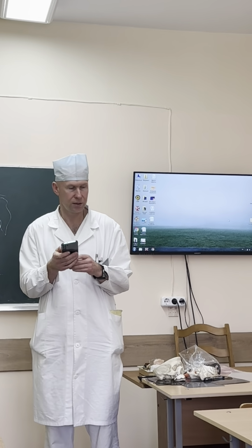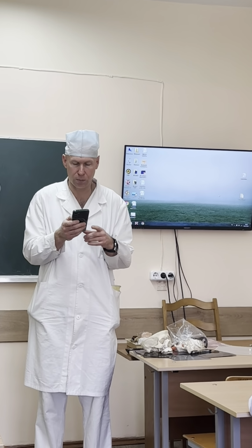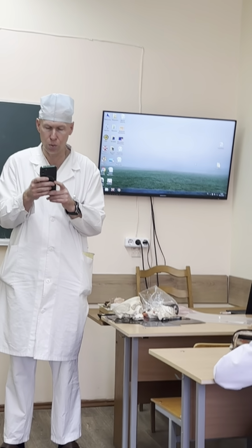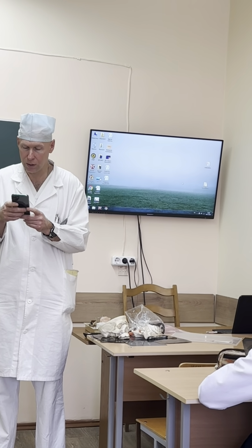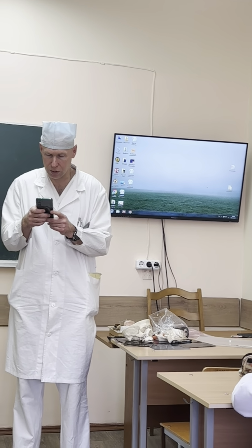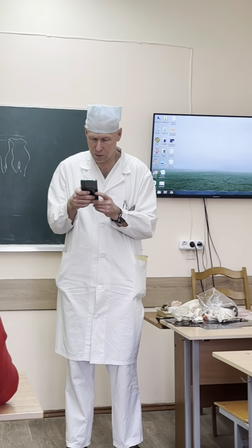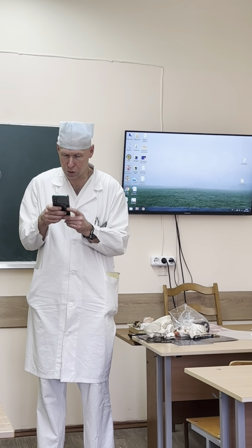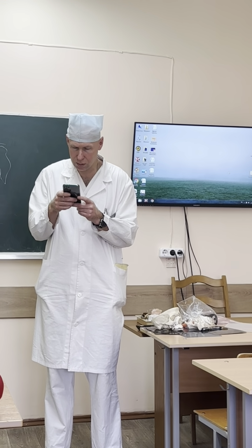Of course, if we cannot see a pathological situation in the X-ray picture, we can do computer tomography. Computer tomography we can do in 3D projection. I can show you the computer tomography. For example, here, not here, next, oh, here.